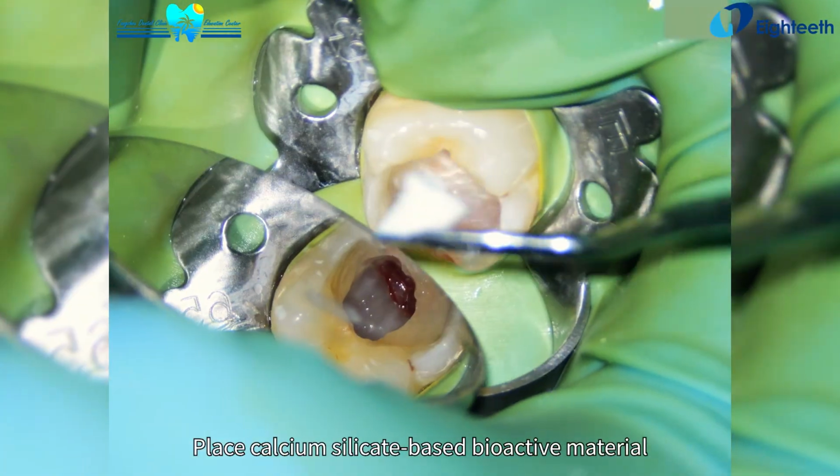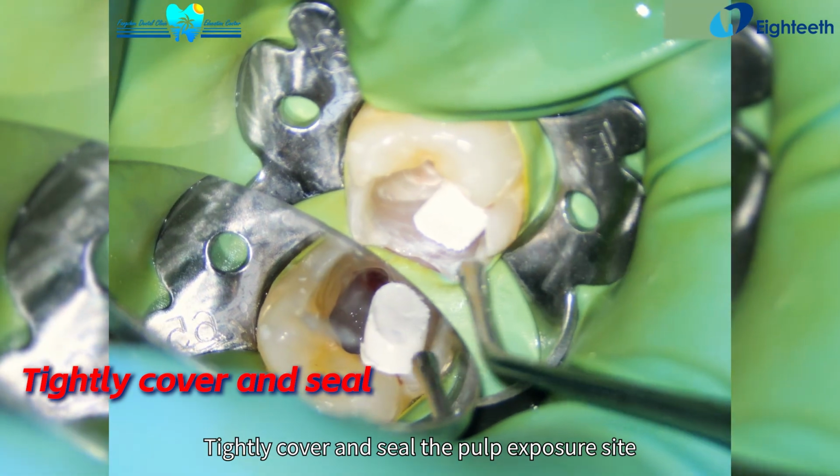Place calcium silicate-based bioactive material. Tightly cover and seal the pulp exposure site.